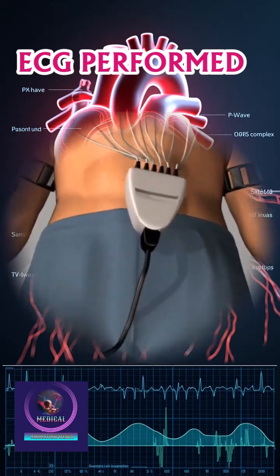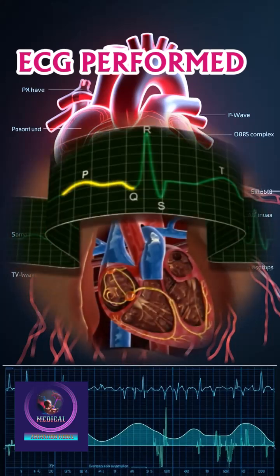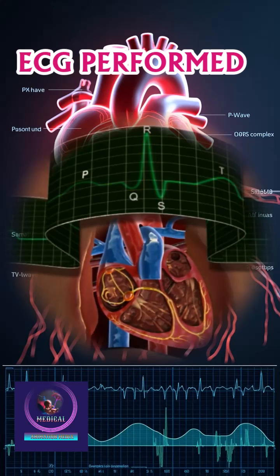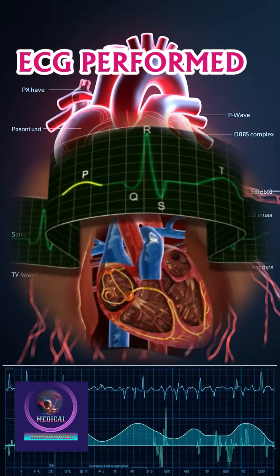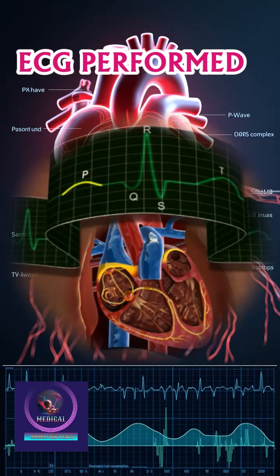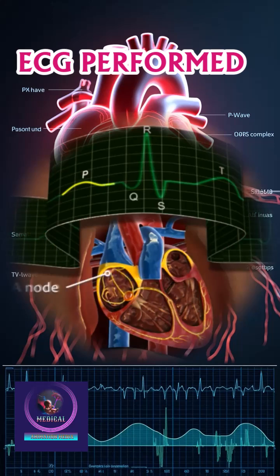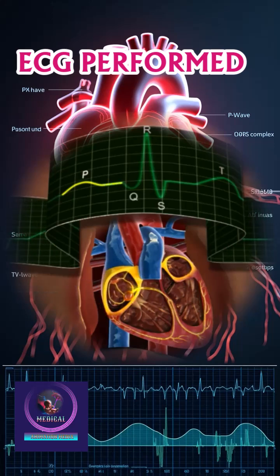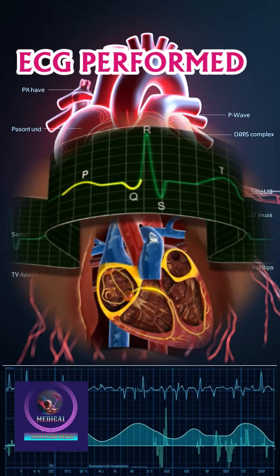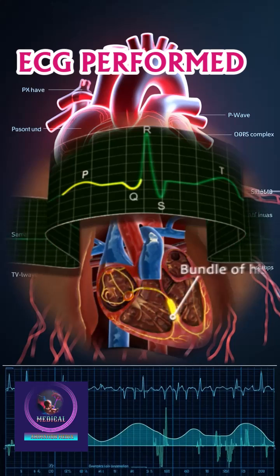A typical ECG consists of a P wave, a QRS complex, and a T wave. The P wave is a small upward deflection that shows the beginning of atrial depolarization, triggered by the sinoatrial (SA) node. The Q wave is a small downward deflection that occurs as the electrical impulse travels through the bundle of His and its branches.